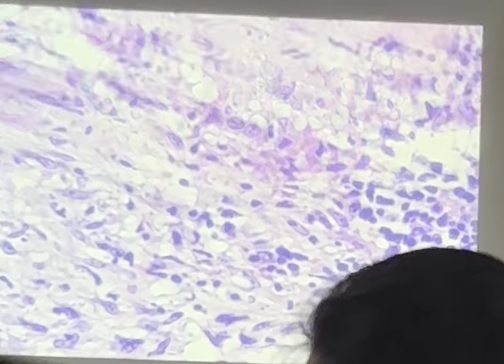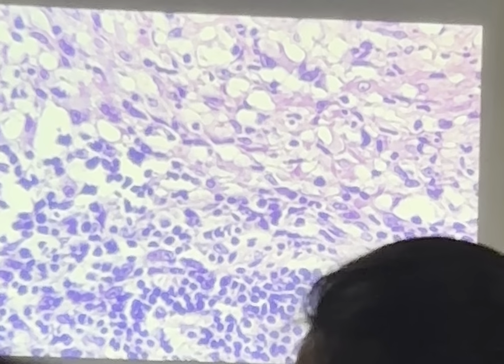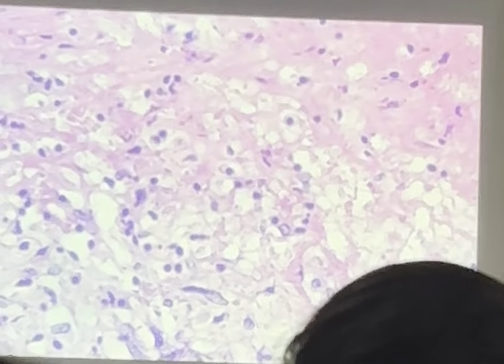Most of these cells that you see, as well as there are some lymphocytes, like the darker circles. Yeah, these dark circle ones are lymphocytes. The other cells are histiocytes. They're larger, kind of look like epithelial cells. Okay? So this is caseous necrosis. This is a granuloma. Okay? And then you have the giant cell. Alright, let's look at another one.